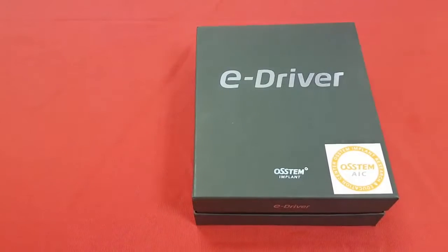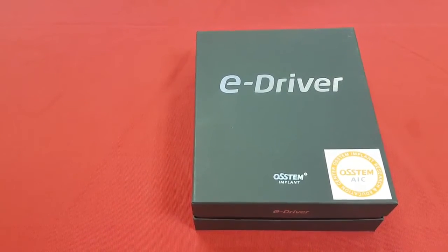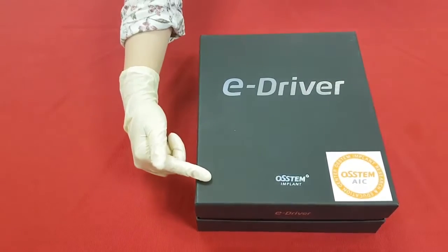This is our new product eDriver, which is used for prosthetic and orthodontic screw tightening. It comes in a refined black box with the product name on it, and you can see the logo here.